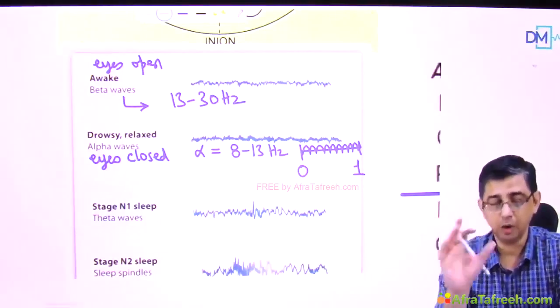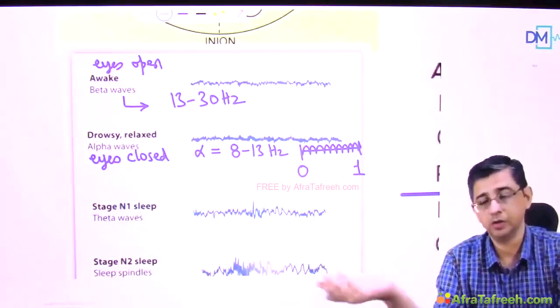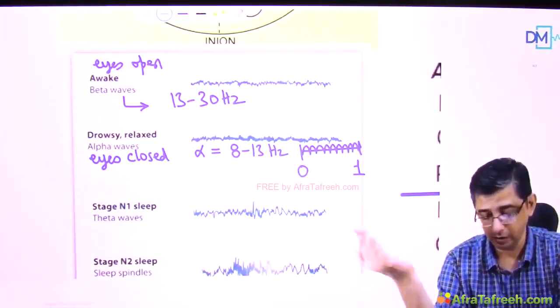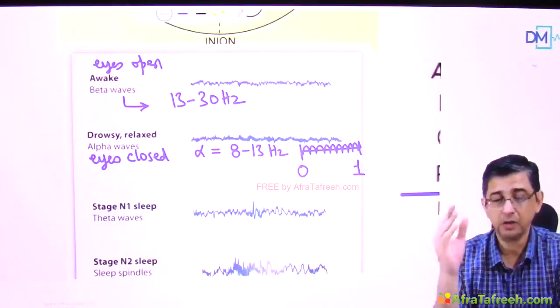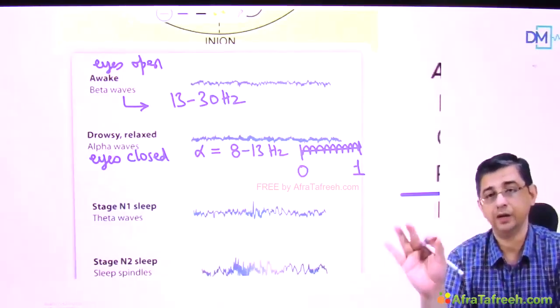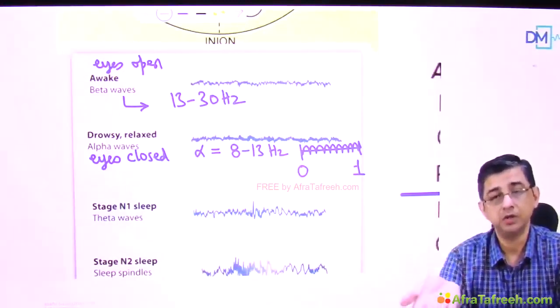So we can see the normal brain activity, and then interspersed in that background rhythm, there could be abnormalities also when you record the EEG for relatively longer duration. Lots of time it's a possibility that when you are recording the EEG, the interictal period, meaning of the word interictal period is that there are 2 episodes that have occurred. In between that, lots of time EEG might be normal also.